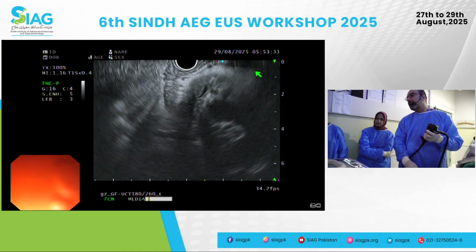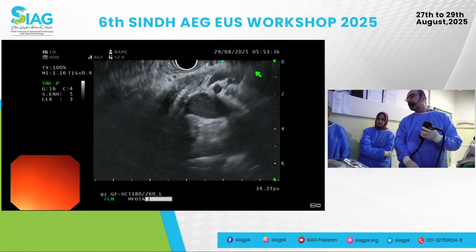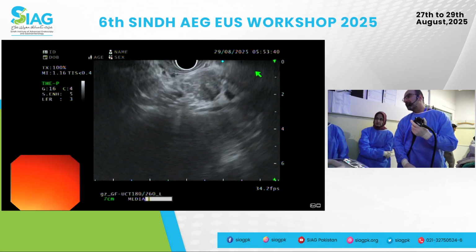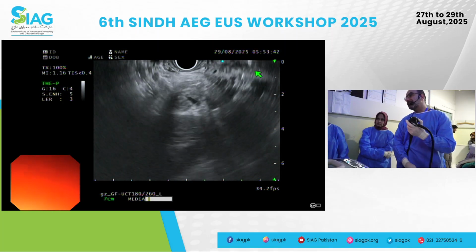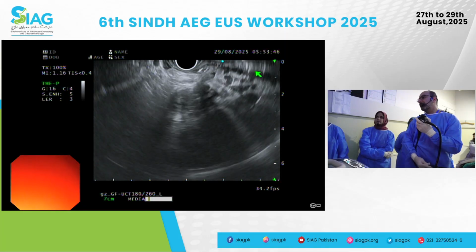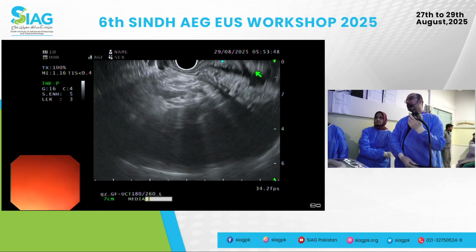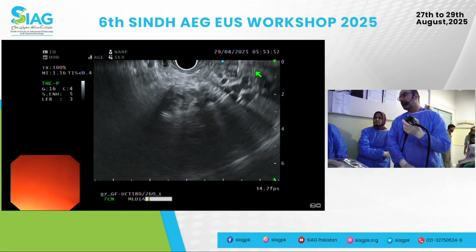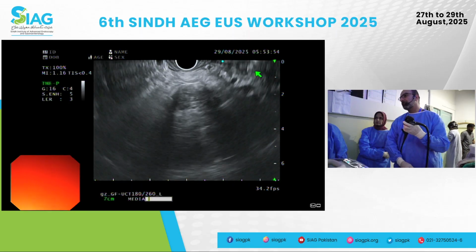In this type of patient, I would personally favor not sampling him right now. The neck and head area is somewhat atrophic. I wouldn't biopsy that. You could consider biopsying this area, but it's going to be a lot of inflammation. And with this being 1.5 times the upper limit of normal, I would just leave that alone. I would not have a low threshold for biopsying.